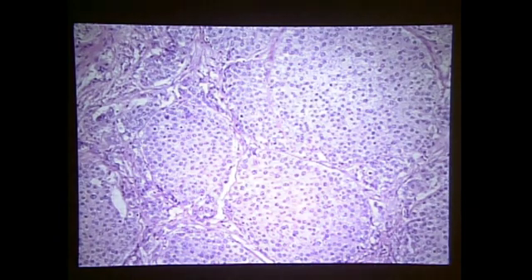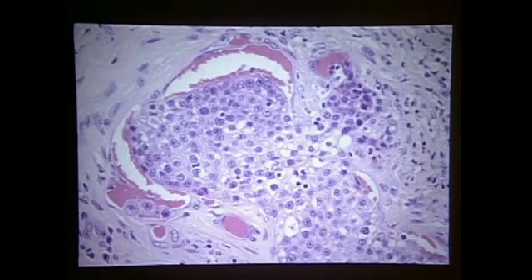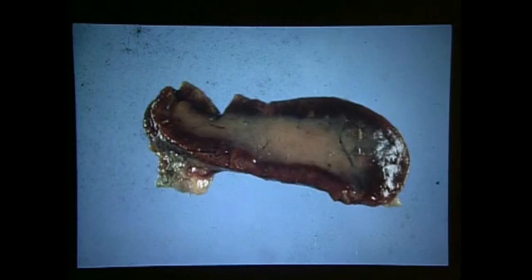However, in one of the cases, it was a malignant thyroid tumor that metastasized into the chest, thoracic cavity. I do not have the appearance of the tumor associated with the primary site, e.g. the thyroid, but this is a microscopic picture. It doesn't really look very malignant here, but nonetheless it has, just like tumors in the dog or in the human being, invaded lymphatics and blood vessels, then being quite evident that this is then a malignant metastasizing tumor.